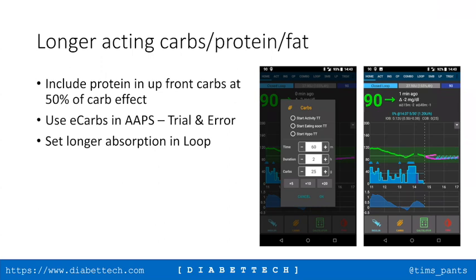The only way it will be able to deliver insulin is as TBRs, which I'm assuming it will be doing, and you'll be seeing TBRs coming off and on. And that's going to be fundamentally a limitation of the way it works. Okay. Sorry that I can't be more helpful than that. Okay, so, anything else on Mealtimes?